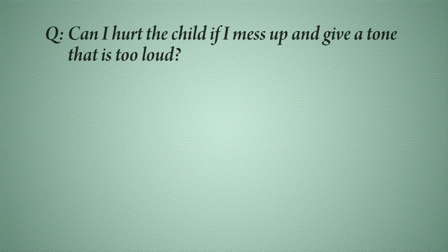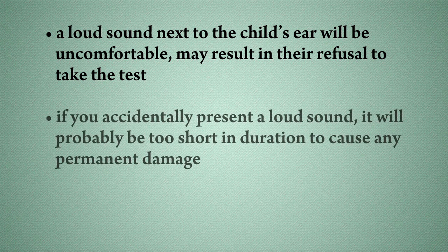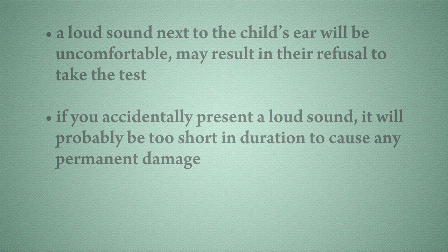Can I hurt the child if I mess up and give a tone that is too loud? A loud sound next to a child's ear will be uncomfortable for the child and may result in their refusal to take the test, so be careful to avoid doing this. If you accidentally present a loud sound to a child, the sound will probably be too short in duration to cause any permanent damage to the child's hearing.